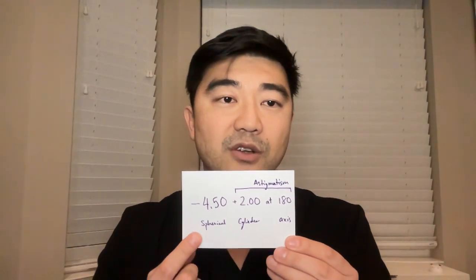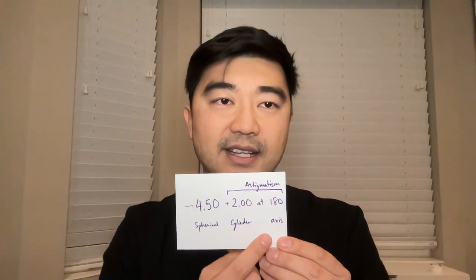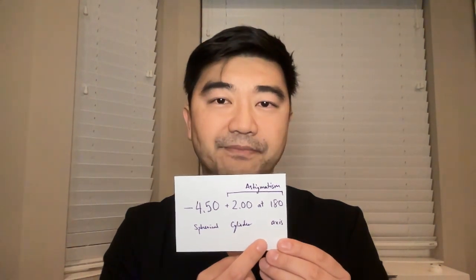The first number denotes the spherical power of the glasses, and the second two numbers define the power of the astigmatism correction, or the cylinder power, and the axis or the rotation of that power. Some may ask, I don't see the other two numbers, so I must not have astigmatism. Well, this is not usually true after the cataract is removed.